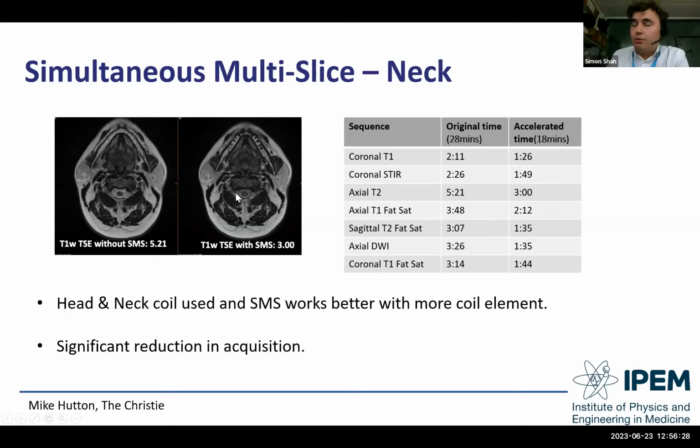You might want to be careful. I've not got a huge amount of experience with simultaneous multi-slice, but you might want to have a bit more coil coverage when you're applying it, because you're going to be exciting slices outside of your field of view.